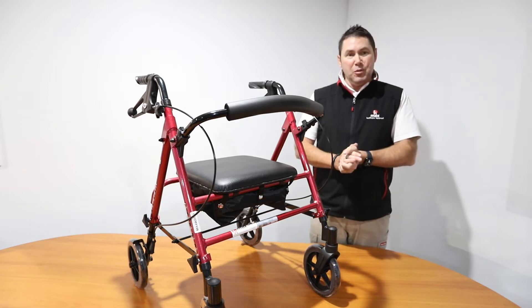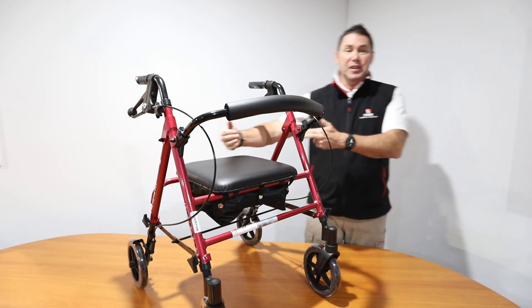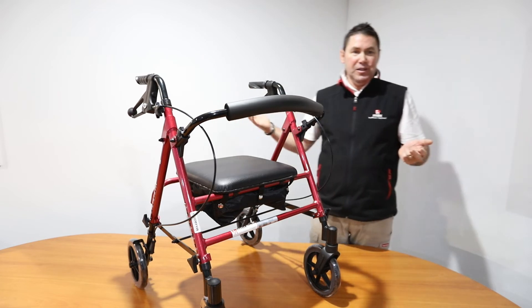The walker has a maximum user weight of 136 kilos. The seat width is 356mm and between the arms there is 460mm.